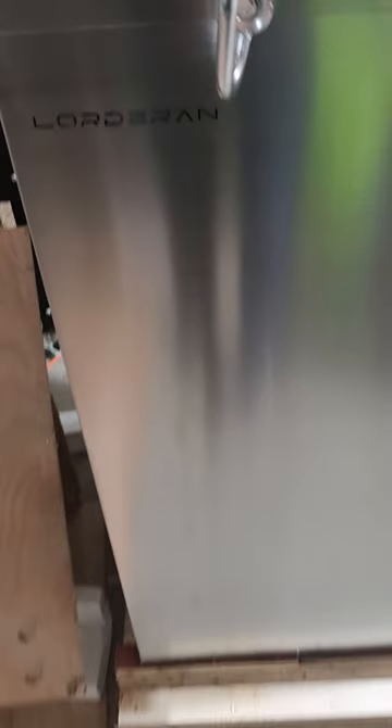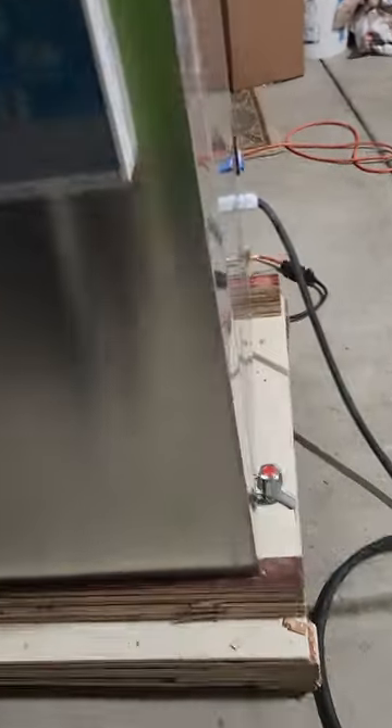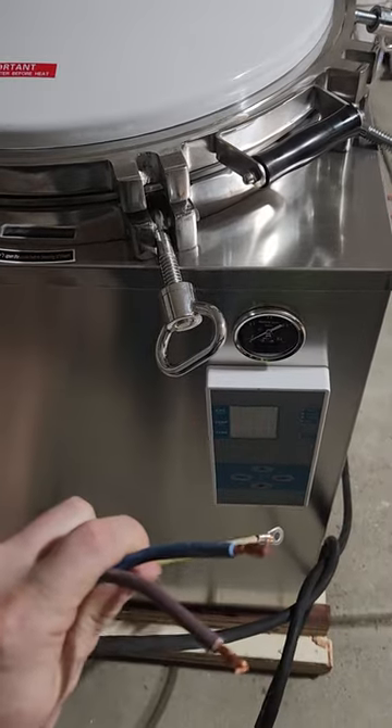This is the Lordor End Steam Sterilizer, 150 liter. Unboxing. Looks like you got some electrical work to do. This is how it comes.